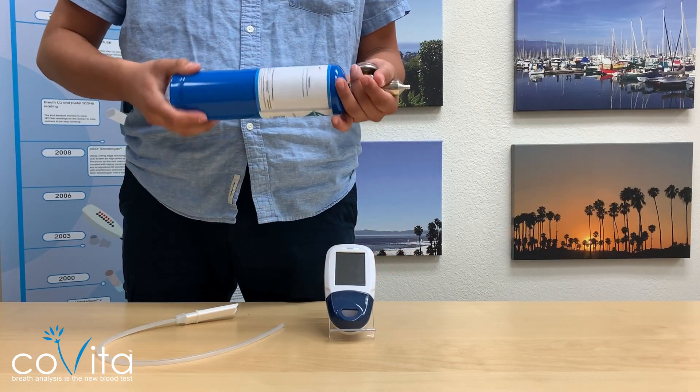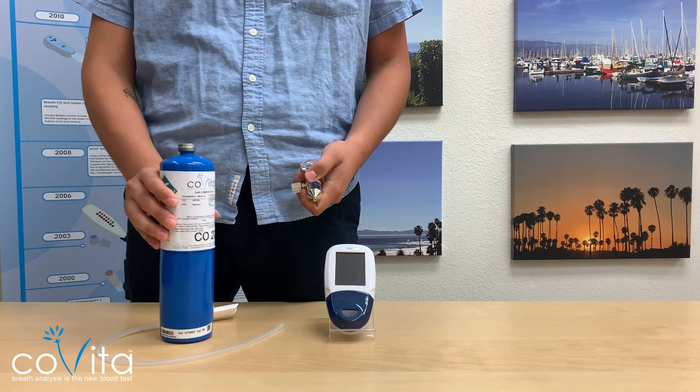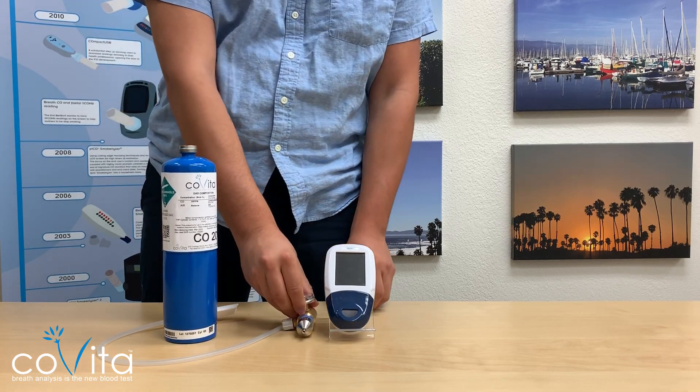After calibration, please remove the flow meter regulator from the gas can. You may hear a pop and this is normal. Remember to replace the dust cap for proper storage.